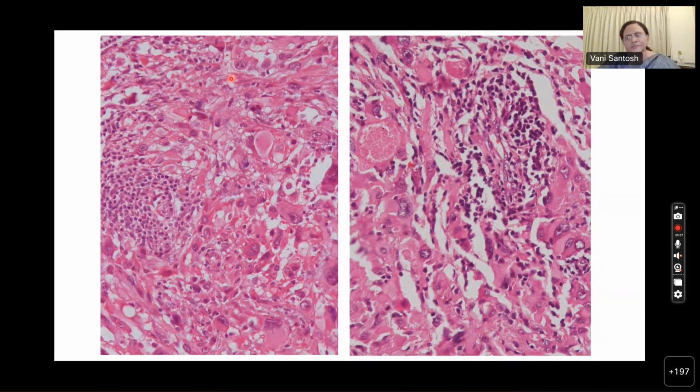You can describe. There are large multinucleated xanthomatous cells. Very good. What is this? There is intracellular accumulation of lipids in some of these cells, yes, it appears lipid. It is pale and xanthomatous. Yes, I agree. What is this one? Just give me these features. That's more than enough. What is this?